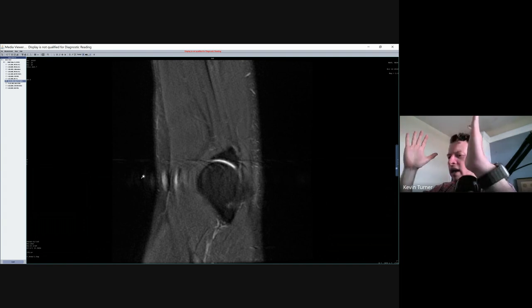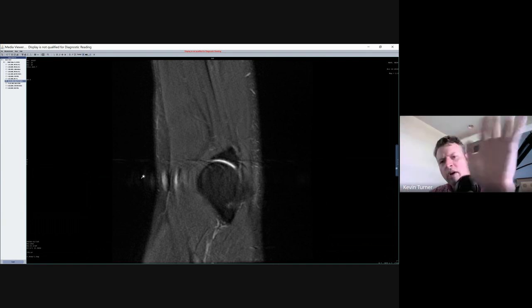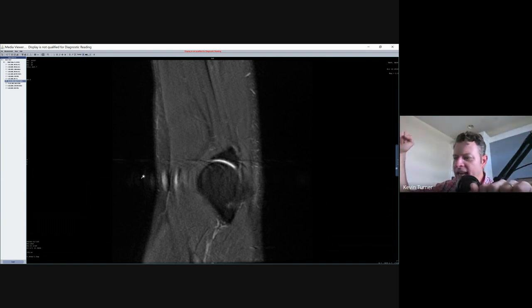So that way the computer can say, okay, you hold still, I'll turn on the gradient. And if the gradient's stronger over here, that anatomy goes over here. If it's weaker over here, it goes over here. But if a patient's anatomy is moving while I'm changing phase, then it just screws everything up. And so the computer just throws all this extra information because it's like, I don't know where it's supposed to go. I was trying to figure out where everything goes based on its speed, based on where it's located, but where it's located changed because the patient moved. And that's a phase encoding problem. Motion is directly caused by issues with phase encoding. Phase encoding didn't happen correctly. That's what motion artifact is. The artifacts we most commonly see are because of the phase.